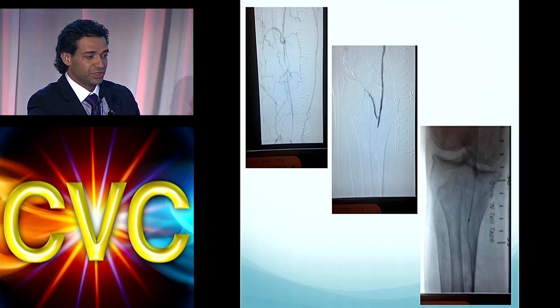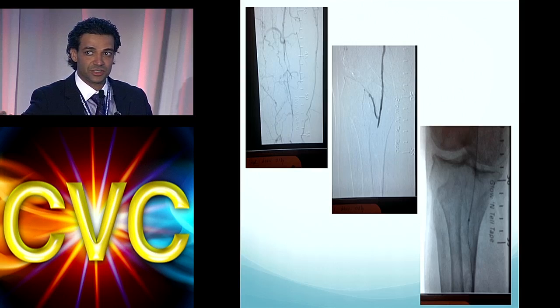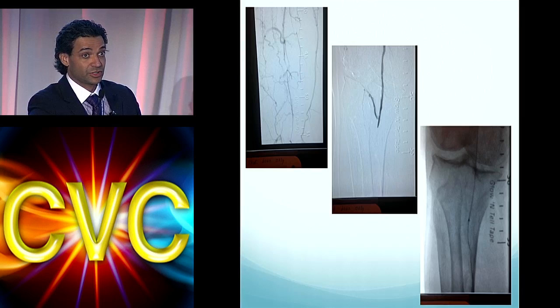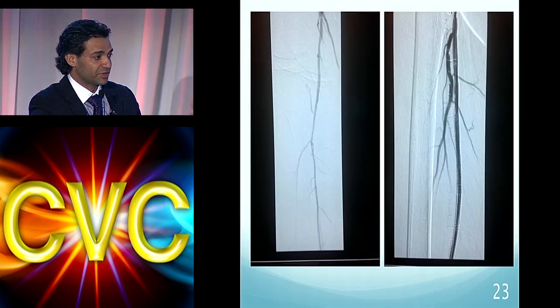And so we delivered the wire, we put the catheter right to the area of debris, and you turn it on, and you just slowly go down past the wire, and then you slowly pull back, and as you're pulling back, just continue to pull it all the way out. And then you'll actually see that debris either in your basket, or sometimes you can actually capture it as it's coming out of the sheath, so just be very aware of that and make sure you aspirate back once you pull everything out.